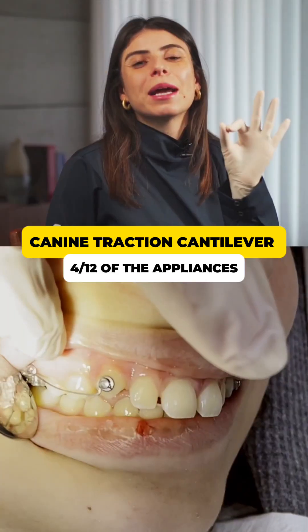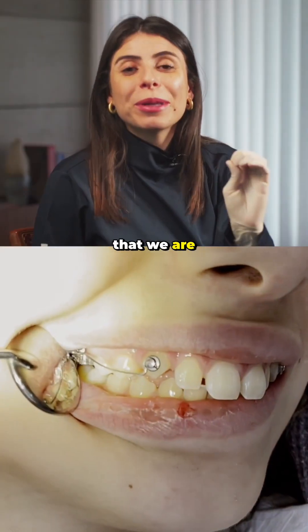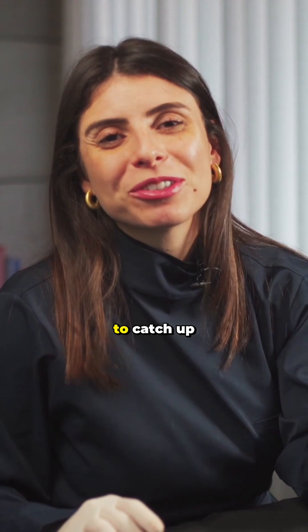Canine Traction Cantilever is our appliance number 4 in the series of 12 appliances that we are presenting. If you're not following this series yet, go back to the previous episodes to catch up.